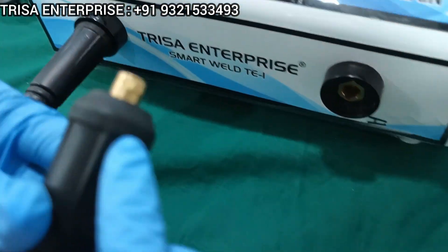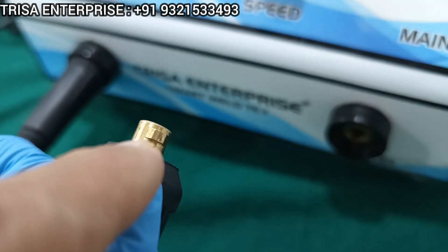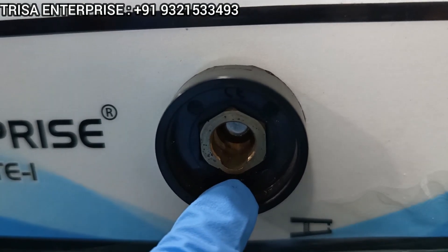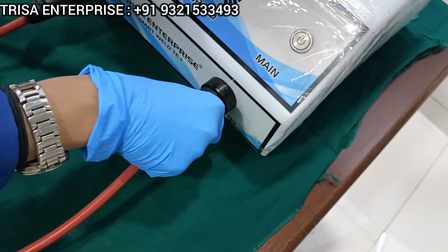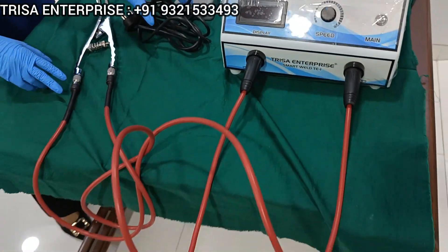What you need to do here is match this small knob over here with the corresponding position on the welding machine. Just lock it in, and once locked, rotate it to secure it. Now this plier has been secured with the machine.